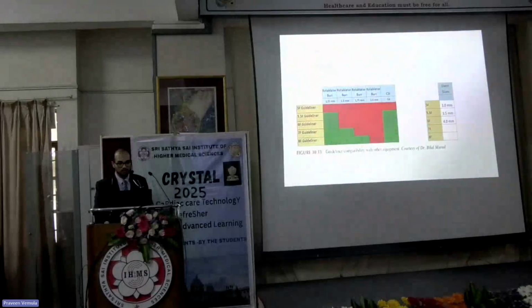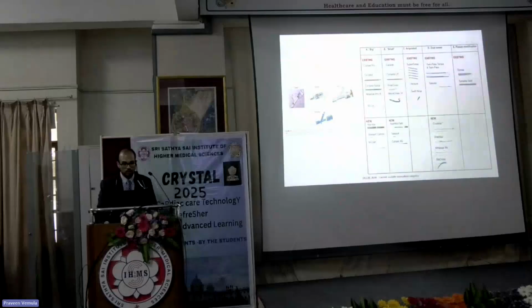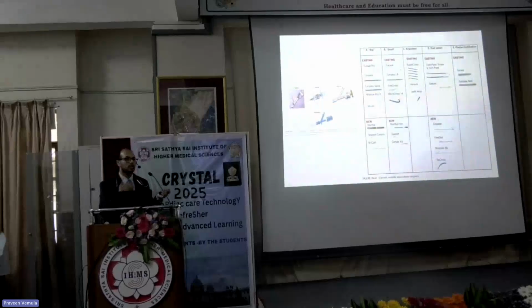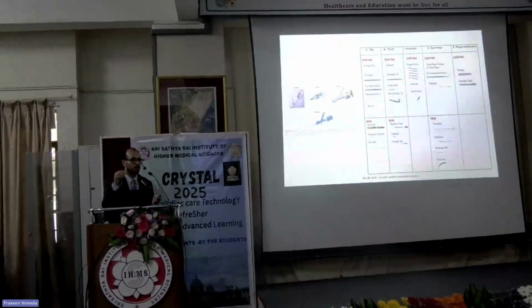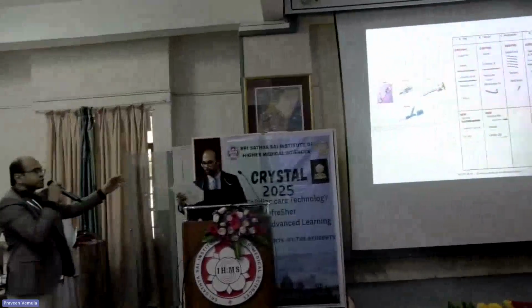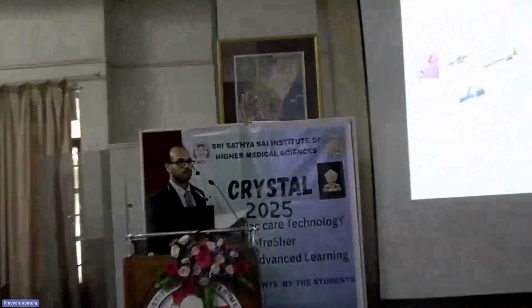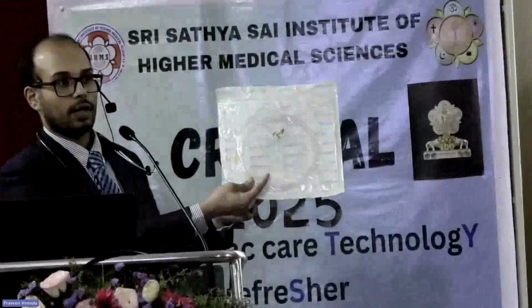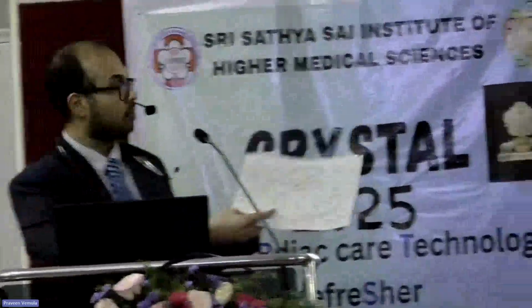So next year. Cool. So balloons, you're there. You're on balloons. These are the microcatheters. Microcatheters. Yes. So for microcatheters, when you cross a CTO, you want to take a microcatheter and make sure you're in the lumen. So you have different types of microcatheters. It's a 2.6 French thing that goes inside the guide. So this is a microcatheter. The one we use here is a Finecross, right? There are other specialty microcatheters also, like a Tornus or a Turnpike, which are the specialty ones to use during CTOs.